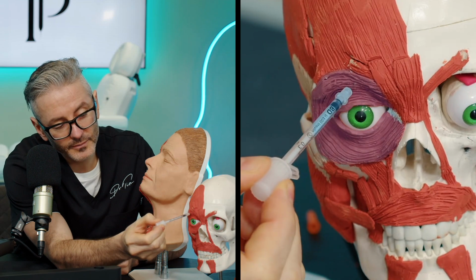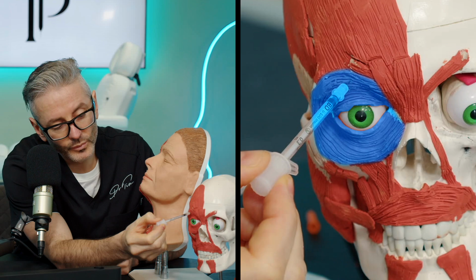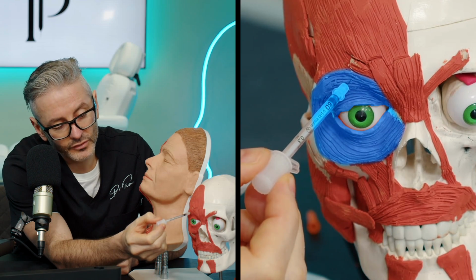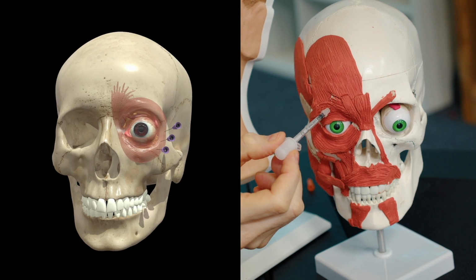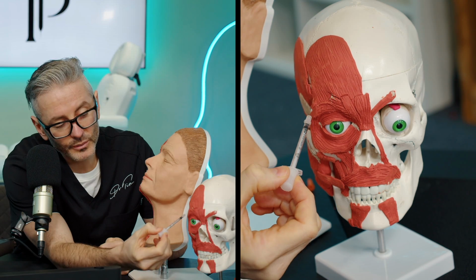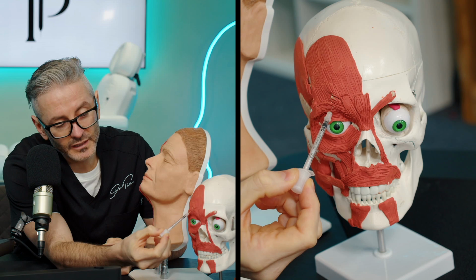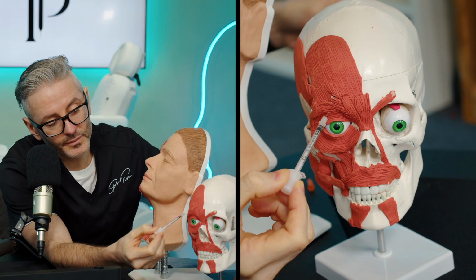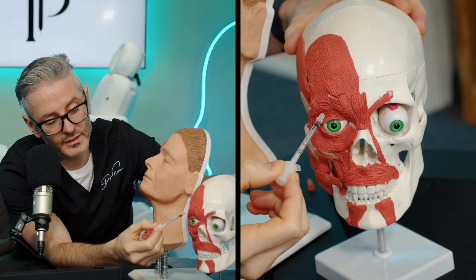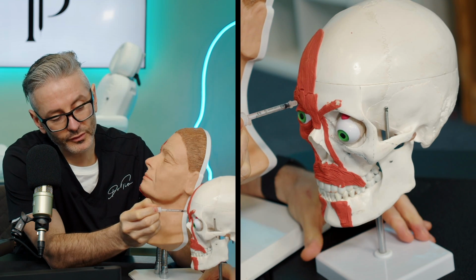The next point we talked about is just 5 to 8 millimeters lower down. And now you can see we are in the orbicularis oculi muscle. Now, this muscle is often treated when we're trying to lift the eyebrow. Most commonly, we get the best benefit for lifting an eyebrow laterally, but you can treat more medially and you can get a little bit of a lift. The only problem is when you go too deep. If you go too deep in this area, you're no longer treating the orbicularis oculi muscle.